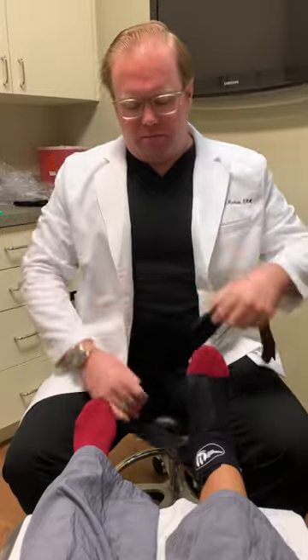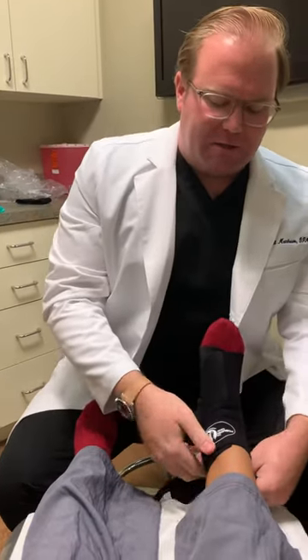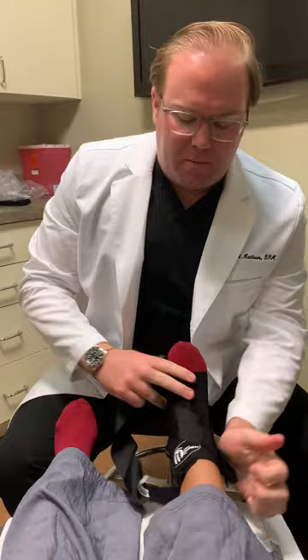Next is the strap, and this is the most difficult part but easy once you get it. The strap looks like this and there's a piece of velcro right here in the center. That piece of velcro attaches to the other piece of velcro on the back of the strap. Step one: attach the strap, and from there you have to attach both the straps — which is very easy if you remember the down, around, and up mantra.